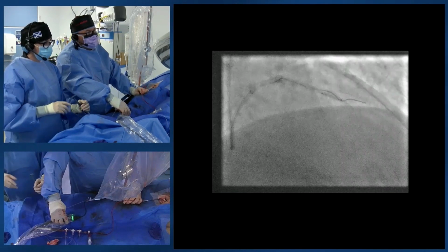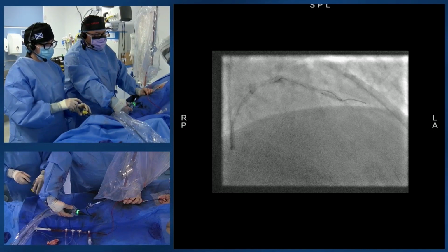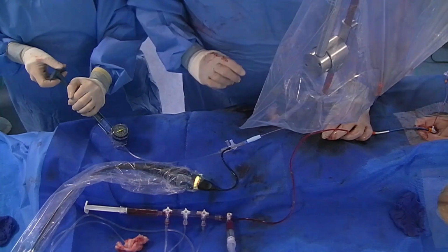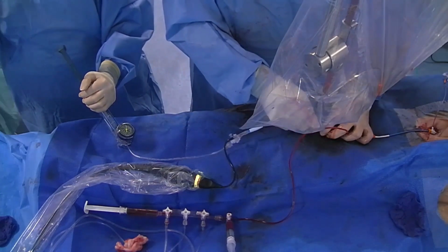It is, and then he's going to deliver therapy. So all he has to do is press that button on the top of the wand, and you can see in the console it counts down. 6 atmospheres. Okay, and then all 10 are delivered. I go to 6 just to push the plaque back, and then deflate. So look to me that, store that, thanks.